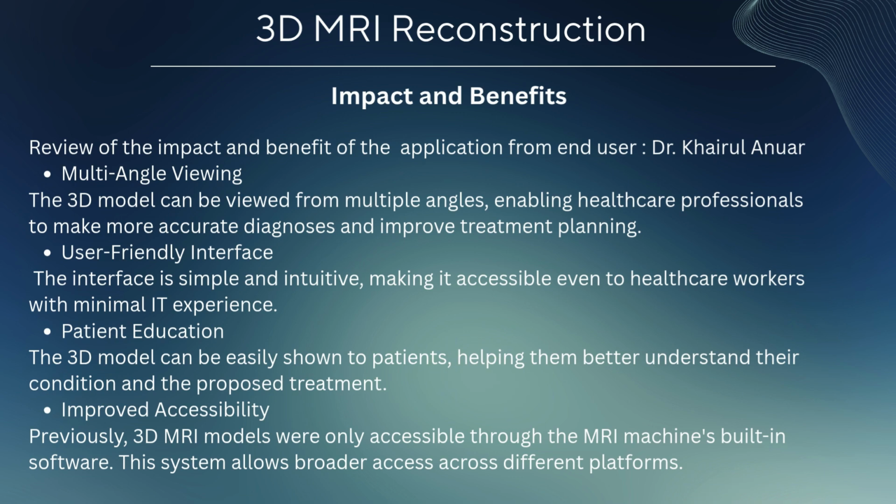Secondly, he praised the user-friendly interface since many healthcare workers may not have advanced IT knowledge. Simplicity and ease of use are critical. Our system's intuitive design meets that need effectively. Another strong point is patient education. With our application, doctors can visually explain the patient's condition using the 3D model. This leads to clearer understanding and greater patient engagement during consultation.